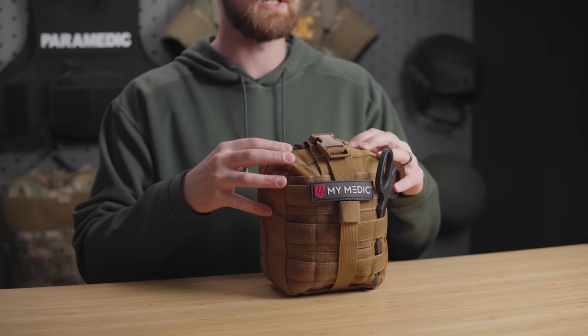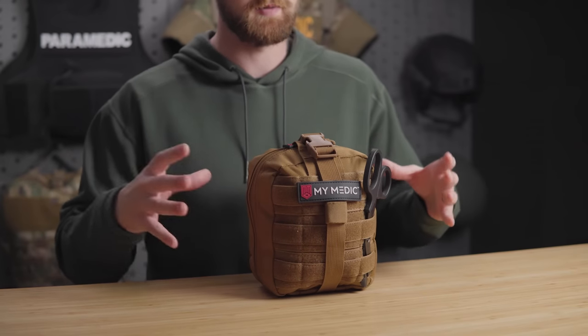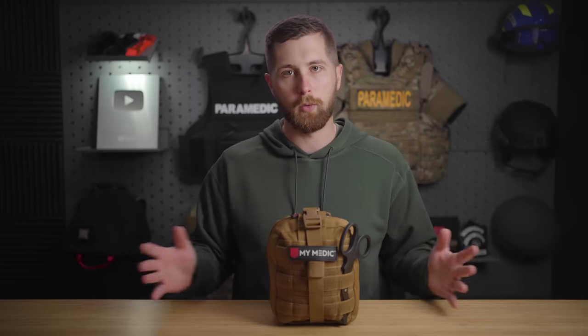MyMedic is a relatively new company and they build medical kits for the consumer, where a lot of IFAC companies really target a specialized audience — police, firefighters, EMS, military. MyMedic is best known for making kits for everyday use. I do have my issues with some of the products they use, however in general I really like that they are trying to bring medical preparedness to the average person, because bystanders can make a huge difference in the outcome of patients.